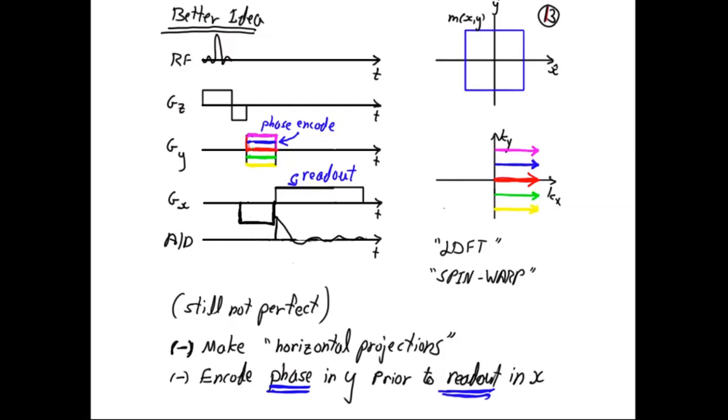What if I do that? If I do that, then the trajectory that I'm going to traverse is I'm going to apply this plus a negative of this at the same time. So in that case, I'm going to move negative in X and positive in Y, right? So I'm going to go in this direction.